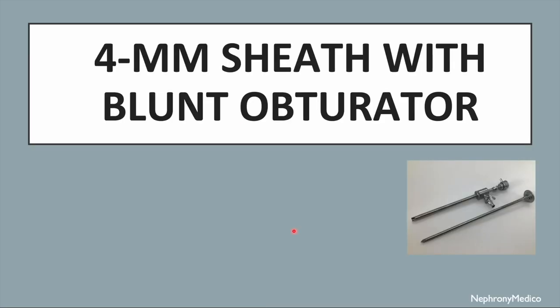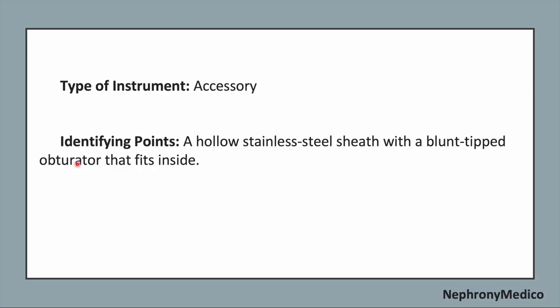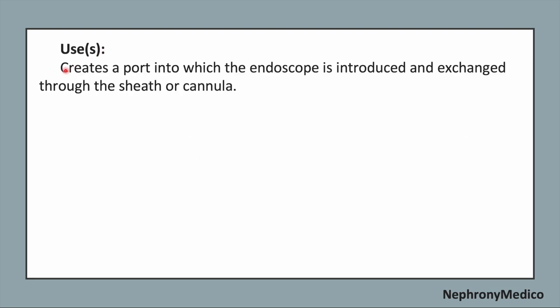Let's talk about 4mm sheath with blunt obturator. Now this is a picture showing 4mm sheath with a blunt obturator. It is an accessory type of instrument. An identifying point is a hollow stainless steel sheath with a blunt tipped obturator that fits inside. Uses. It creates a port into which the endoscope is introduced and exchanged through the sheath or cannula.